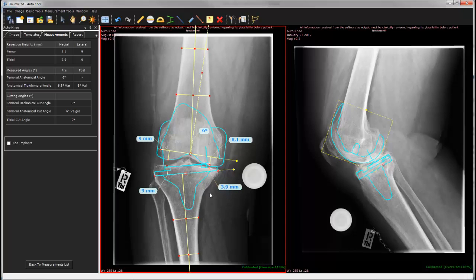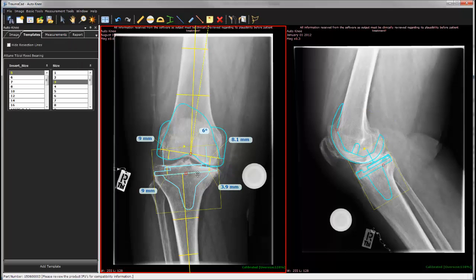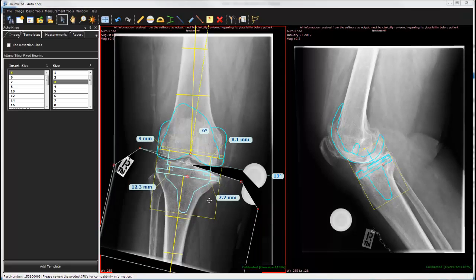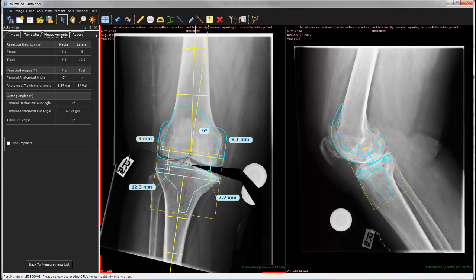You can fine-tune your planning by moving the objects, rotating, or changing the template sizes. Finally, visualize the expected knee alignment. All the measurements are displayed on the left panel.